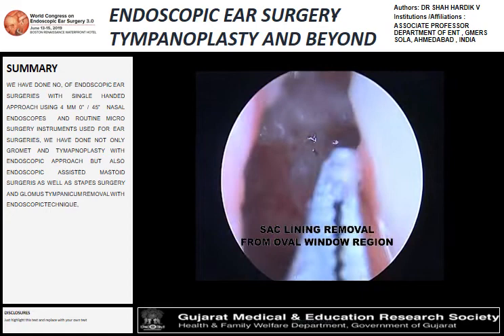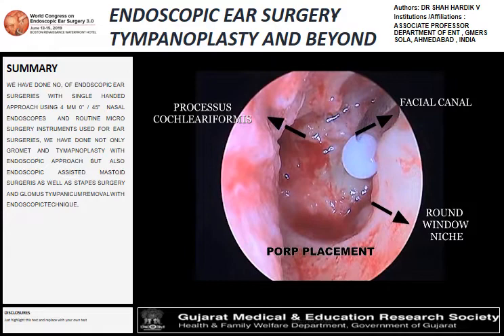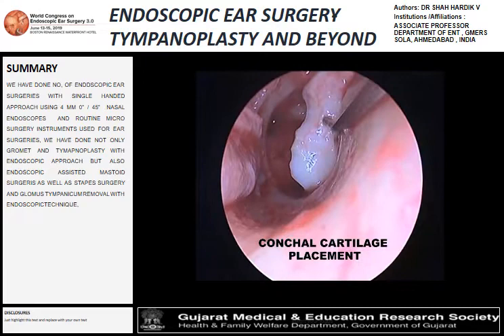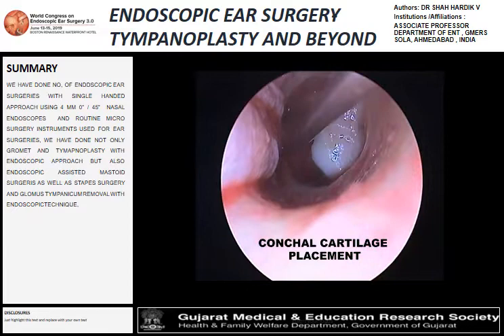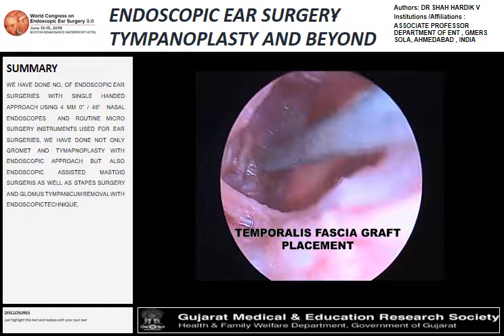With the use of the endoscope, we could remove all the epithelium from the blind areas of the mastoid cavity — from the aditus and antrum. That's the position of the piston over the oval window. The next step is cartilage placement and graft placement with temporalis fascia, with repositioning of the elevated canal skin.